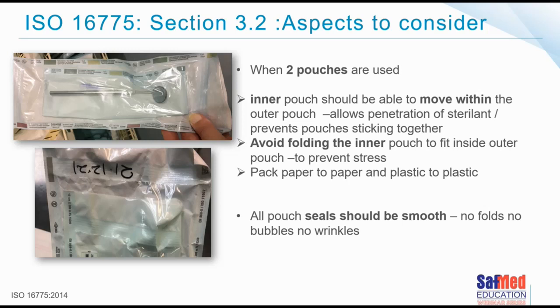Folding the inner pouch will create additional stress on the seams and the seals. Always, of course, remember to pack paper to paper and plastic to plastic. All seals we know should be smooth, no folds, no bubbles, no wrinkles.